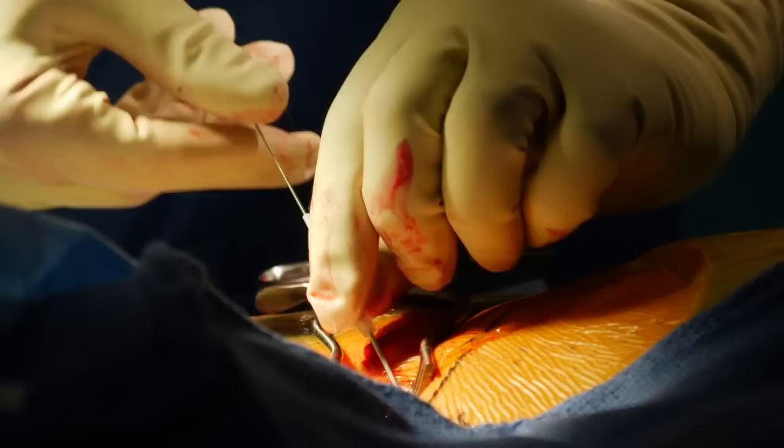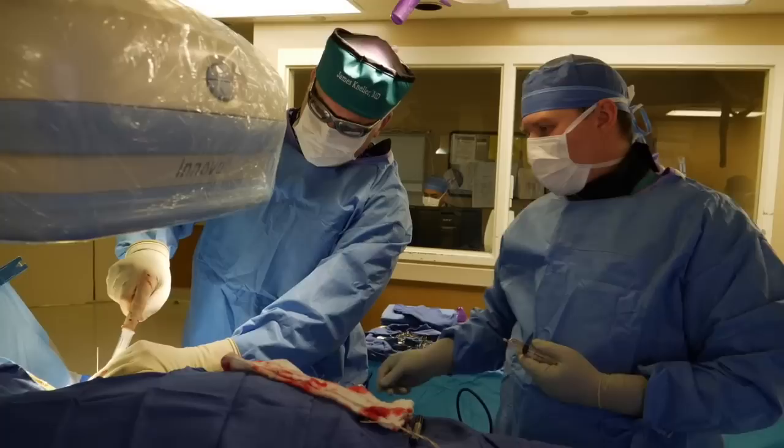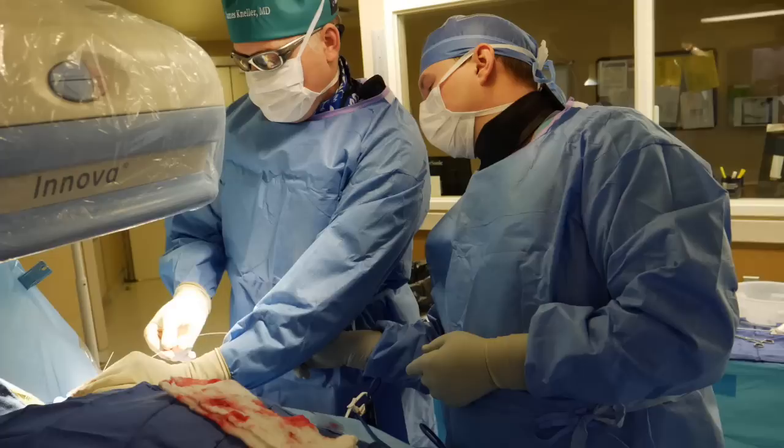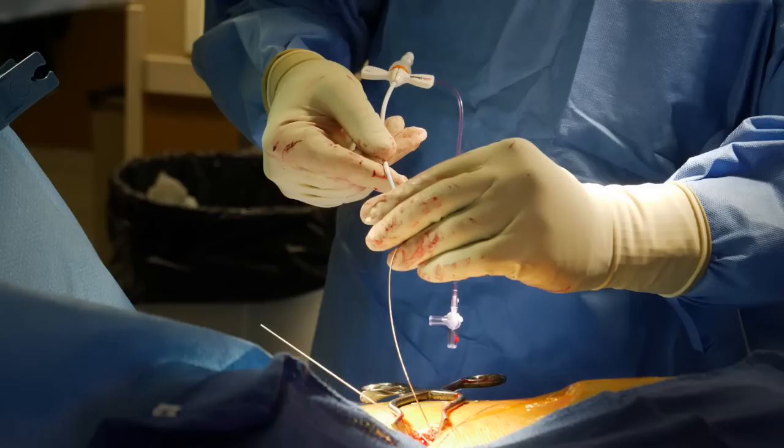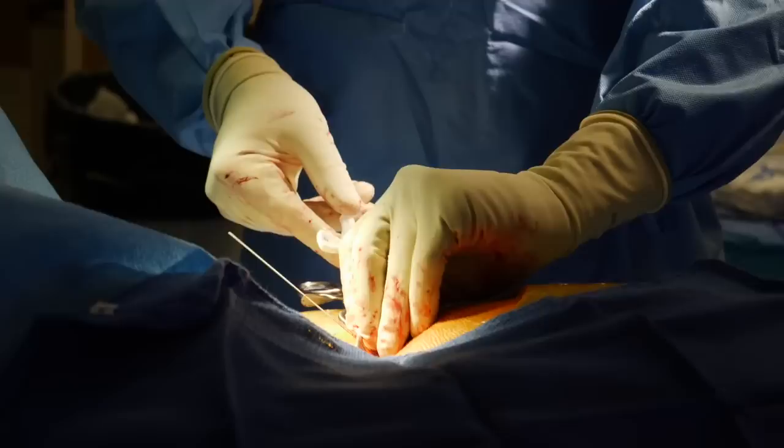There you see that larger guide wire going in through the veins, down to the heart. Out comes the outer sheath. We'll get the second access site for the second insertion — this is for the second lead down to the bottom chamber of the heart. There's our needle accessing the vein, passing the guide wire exactly as before. And here is the larger outer sheath through which we'll implant the pacing leads — that goes over the guide wire into the vein, advancing it to guide our lead.